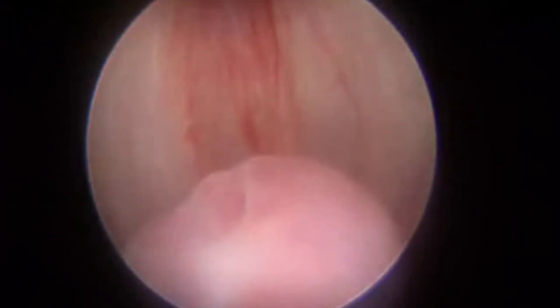As we come back, you can see from the verumontanum the valve leaflets come out distally and then fuse in the midline to form a membrane-like appearance. There are 2 leaflets coming distally, and that is the sphincter you saw just now.